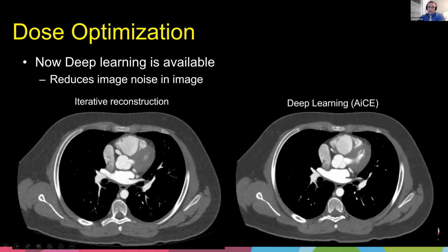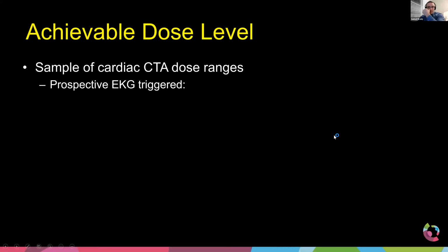So I would argue the bone structure is a little tighter, a little more edgy. And so that would be the same for the arteries and whatnot. If I actually had a close-up image of the heart, you'd probably be able to see the coronary arteries, and the edges would be a little bit more enhanced, a little more distinct. So those are just the images.